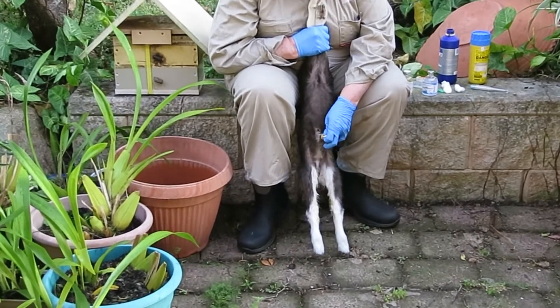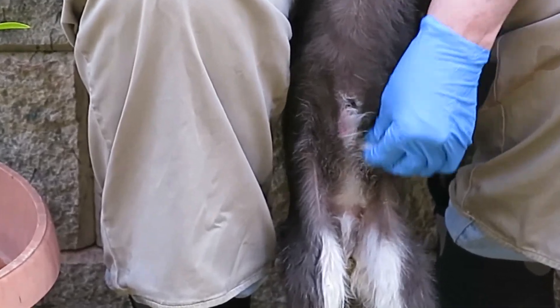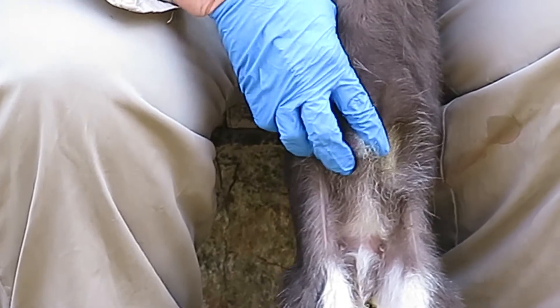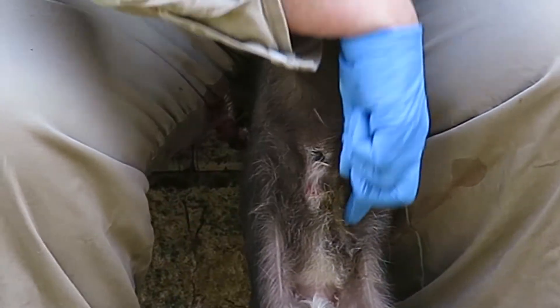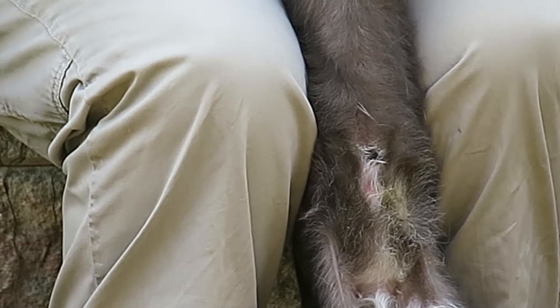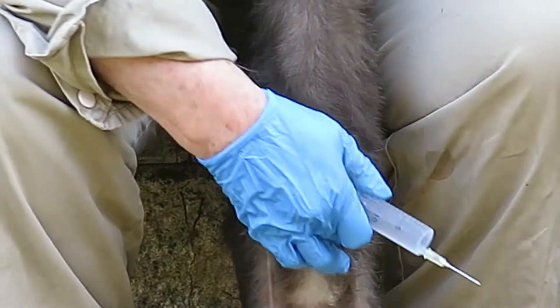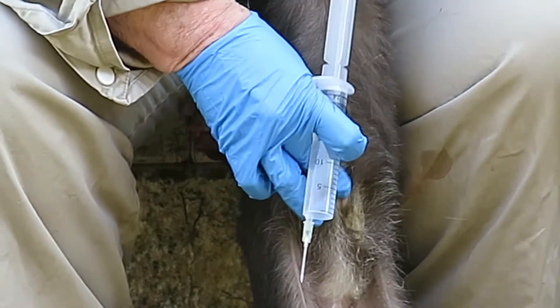Go one centimeter to one side and two centimeters down to give an intraperitoneal injection. Swab the outside skin with a disinfectant and aim the needle towards the hip. For a small kid this works out at about 25 mils of a 20 percent solution for a tiny kid of a dairy breed.